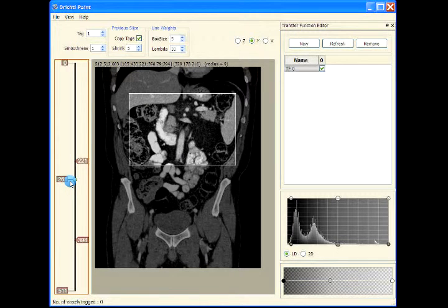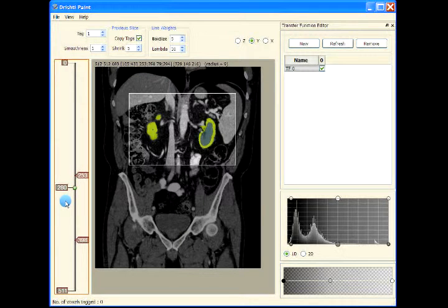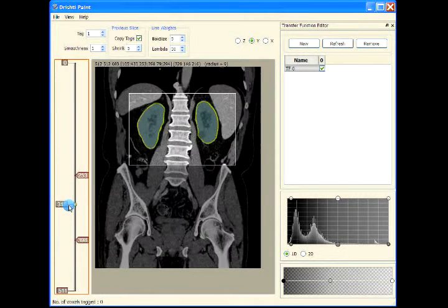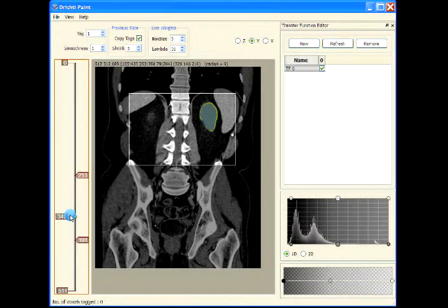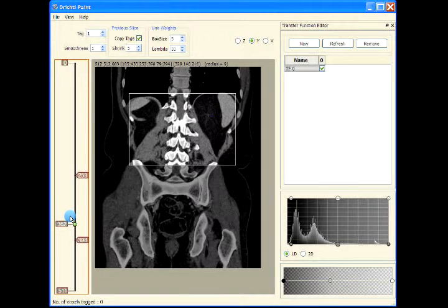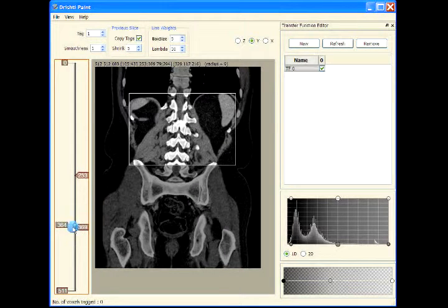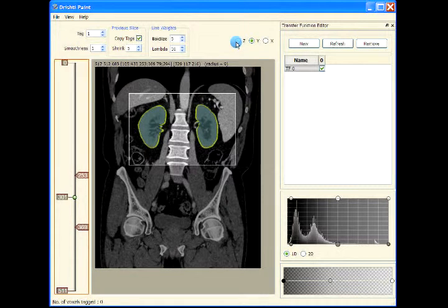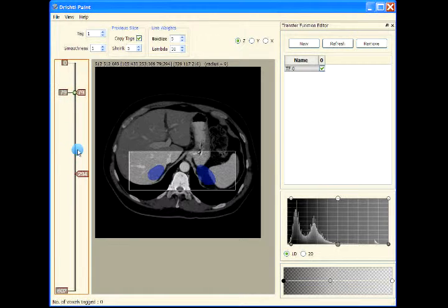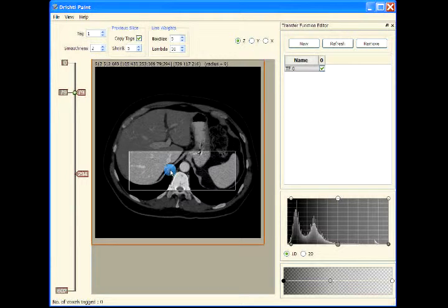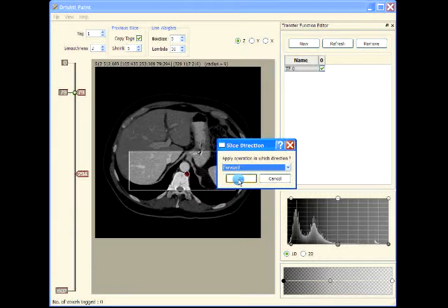What we'll do is apply some smoothing so that the final result will look much better. Let's apply some dilation first.